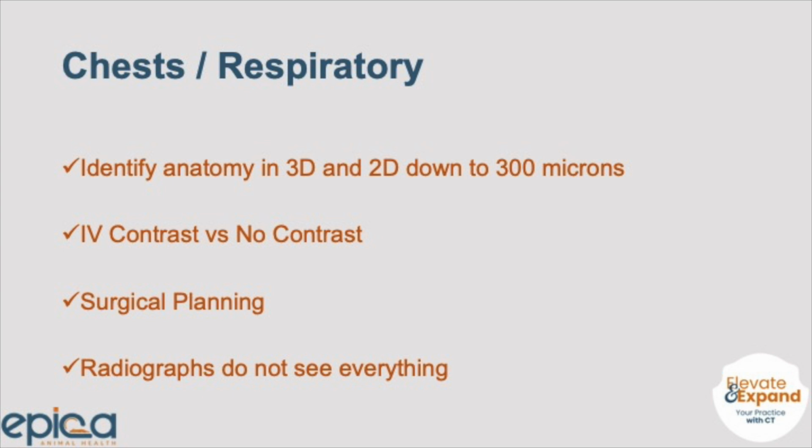And of course, we all know that radiographs do not always see everything in the lungs. In most cases, it underrepresents what truly is going on in the lung fields. So we use CT as often as we possibly can when it comes to respiratory cases and respiratory diseases.